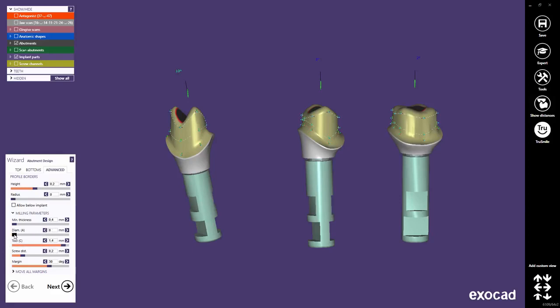We recommend to add at least 0.2 mm to the smallest tool size. This parameter influences the shoulder profile. Tool C sets the diameter of the tool used to mill the superstructure, crown or coping. This parameter influences the profile at the occlusal edges of the abutments. A small diameter leads to sharp edges. A bigger diameter creates round edges. Please note that these parameters must be set correctly if you want to design and mill the abutment and coping in one single CAD session.